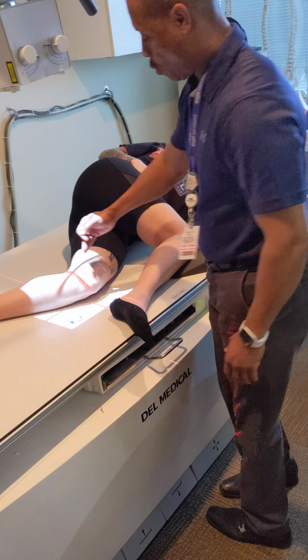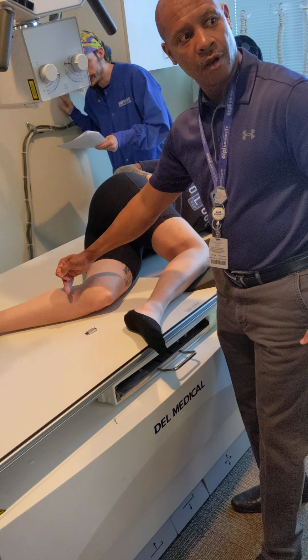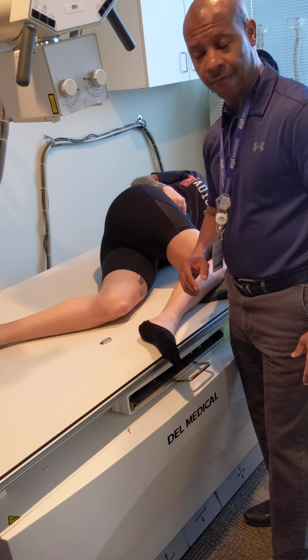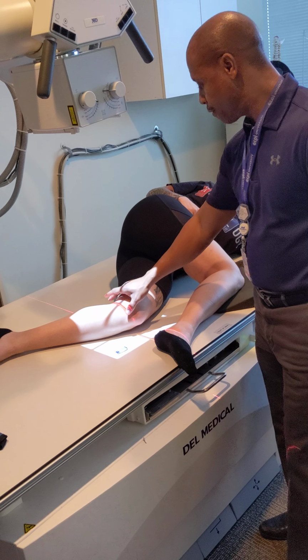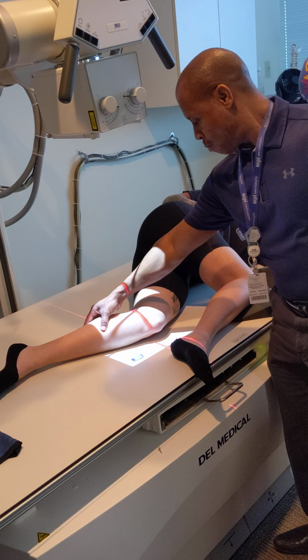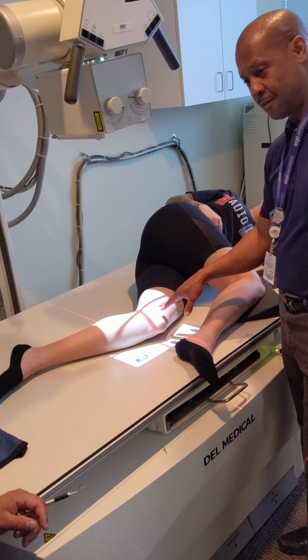Okay. Now, what's going on here? Slight flexion. Okay. 20 to 30 degrees. All right, 20 to 30 degrees. Okay, no more than that. So, all right, flex your knee 45 for me. Okay, that's almost 90. Too much. But come on, more. Yeah, so about right there is actually what we need to do. That's realistic. This is it.